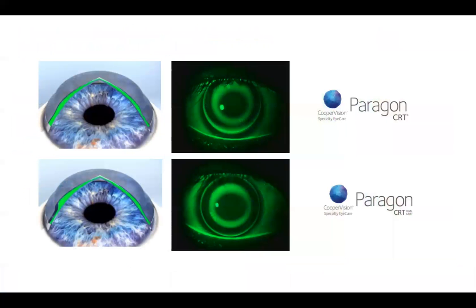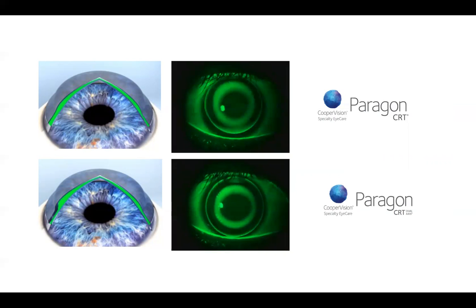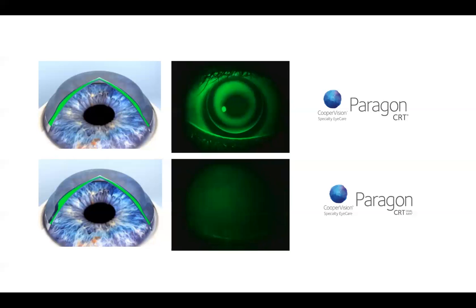So once again, here is a quick video summarizing a spherical CRT lens on a toric cornea. As you can see, we don't achieve complete 360-degree alignment in the mid-periphery, and therefore we want to use a CRT dual axis lens with 2 RZD depth differences. And that secondary RZD2 with increased sagittal depth helps give us that nice 360-degree landing.